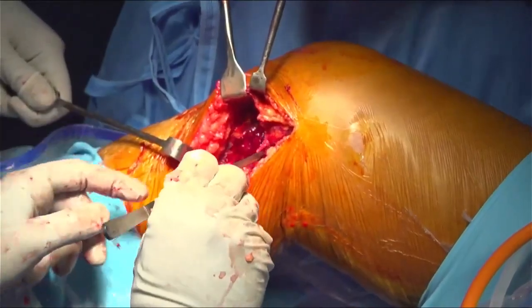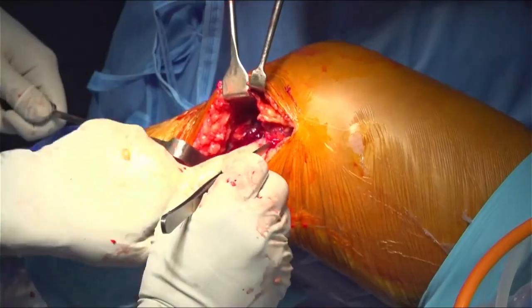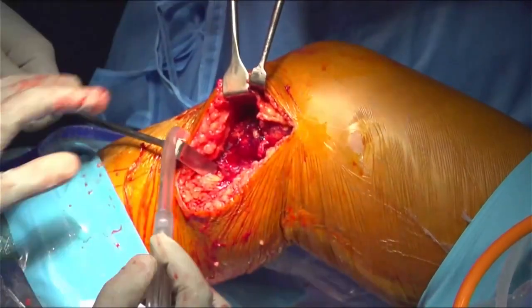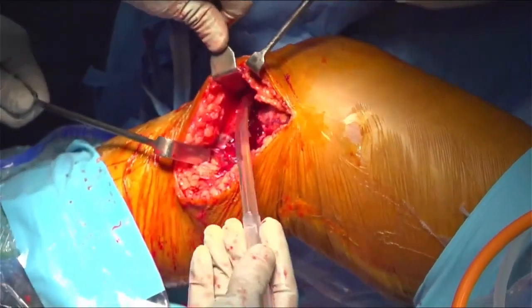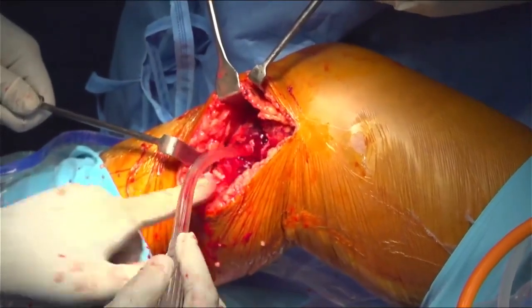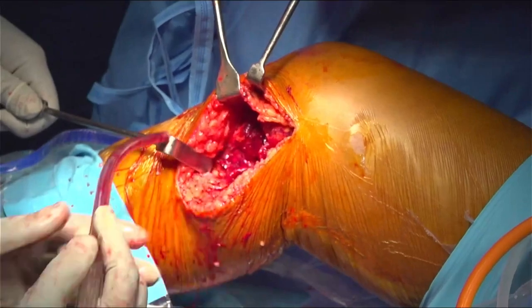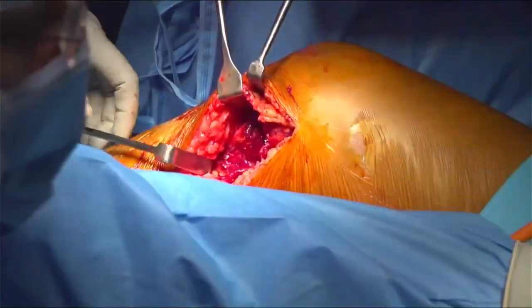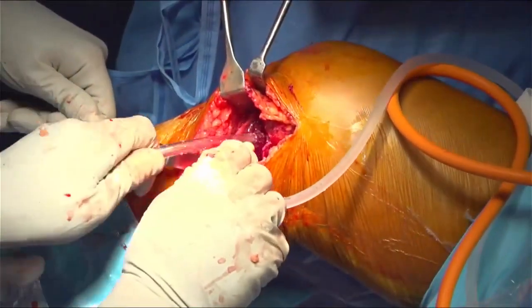Curette, Vinod. Curette and wash. So this is the area where it is denuded. This whole area is actually off the MCL attachment. Wash, curette please. Wash and curette. So we'll give a thorough wash here.